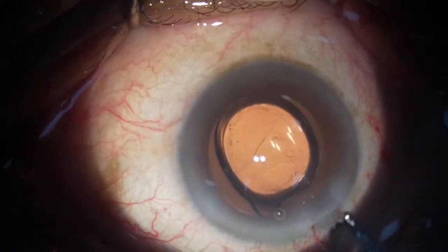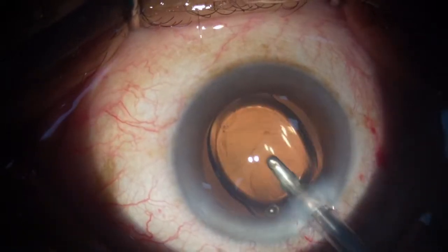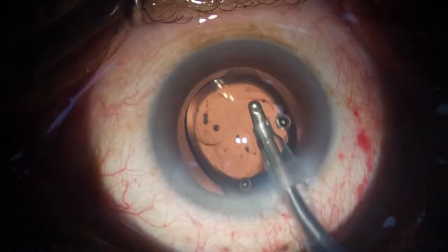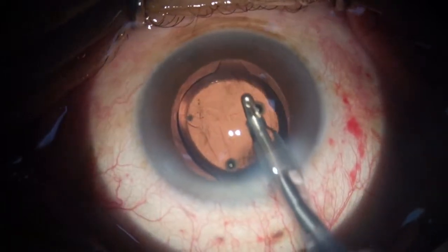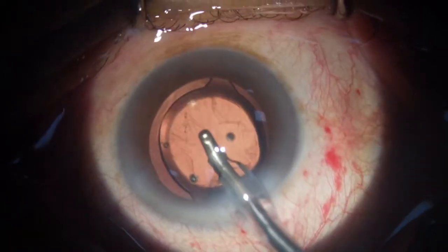Though this is not an EDOF, it can behave like one, and I've been trying to toy around with it, trying to make some patients slightly myopic in one eye. And I do see that the patients are doing pretty well after getting them myopic.